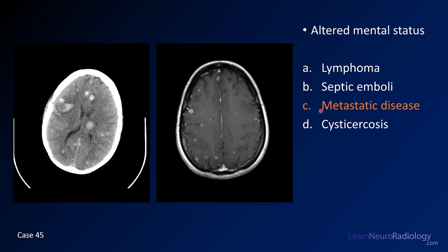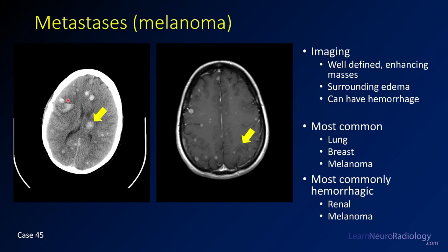This is a case of metastatic disease. On CT you see multiple hyperdense masses — one has a hematocrit level — these are hemorrhagic masses with small scattered areas of hemorrhage, many at the gray-white junction. Post-contrast imaging confirms numerous masses. Because of the location and the associated enhancement, you have to be thinking about metastatic disease.